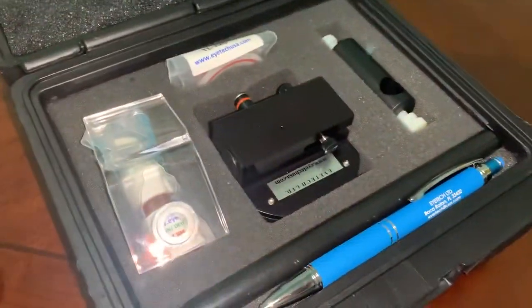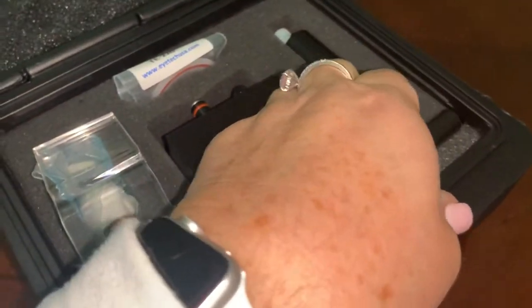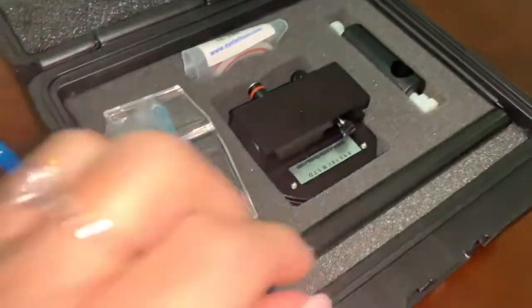Let me just show you what comes with the package. We've got a nice pen here, and then we've got the model eye itself.